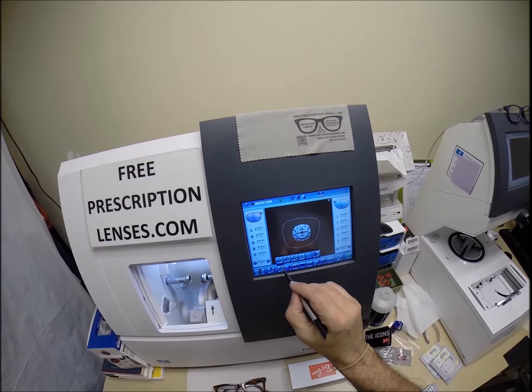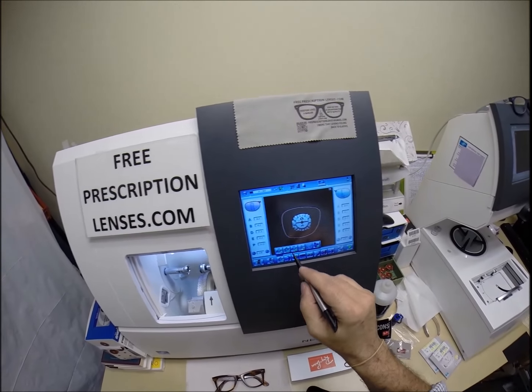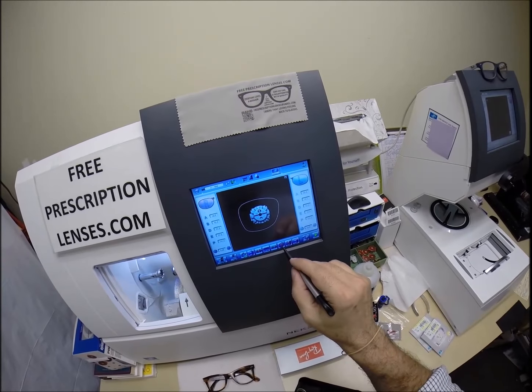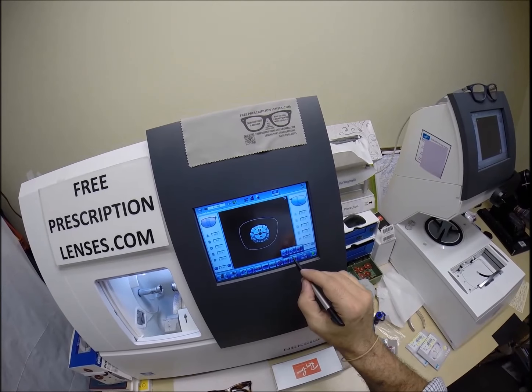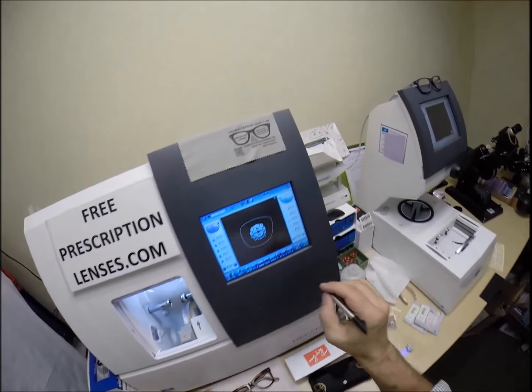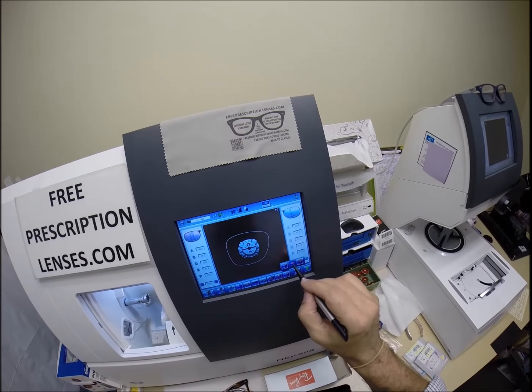These are polycarbonate lenses. If they were plastic, high index plastic, or Trivex, I would select that. I'm not going to polish the edge of your lens because it won't be seen in this frame anyway. I'm not going to put a safety bevel on the front convex surface of the lens because it will not be protruding out of the frame. I only put a safety bevel on the rear concave surface of the lens.